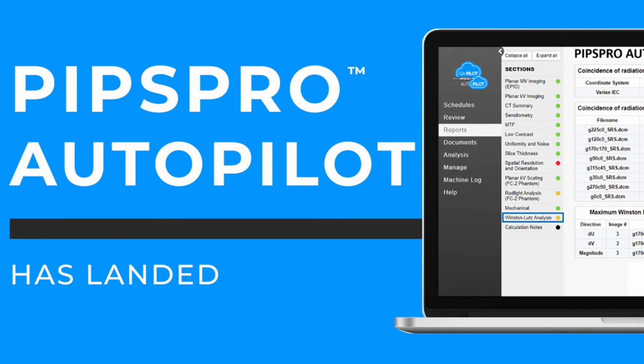For those of you looking for more automation in your QA routines, we're happy to announce that QA Pilot with PIPSpro AutoPilot has landed. PIPSpro AutoPilot is an add-on new feature for our remarkable QA Pilot platform for physics QA management that allows users to take advantage of our automated analysis of image-based tests.